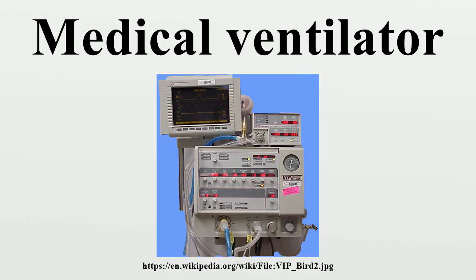They may have manual backup mechanisms to enable hand-driven respiration in the absence of power. They may also have safety valves, which open to atmosphere in the absence of power to act as an anti-suffocation valve for the spontaneously breathing patient. Some systems are also equipped with compressed gas tanks, air compressors, and/or backup batteries to provide ventilation in case of power failure or defective gas supplies, and methods to operate or call for help if the mechanisms or software fail.